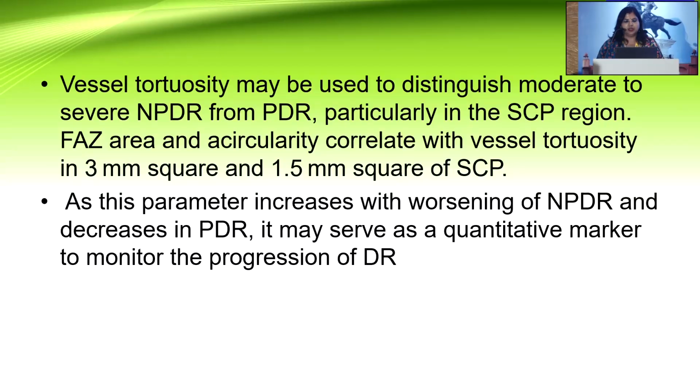FAZ area and acircularity correlate with the vascular tortuosity in this zone of superficial capillary plexus. As this parameter increases with worsening of NPDR and it decreases in PDR, it may serve as a quantitative marker to monitor the progression of diabetic retinopathy.